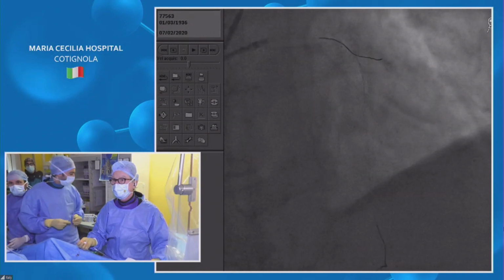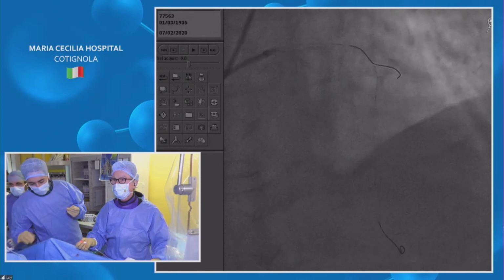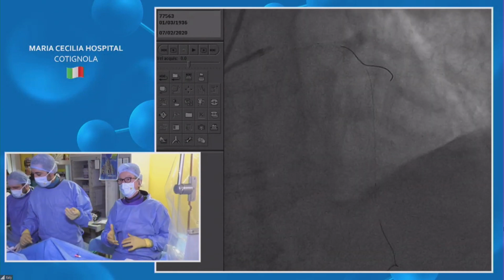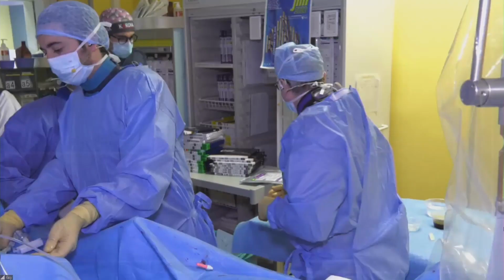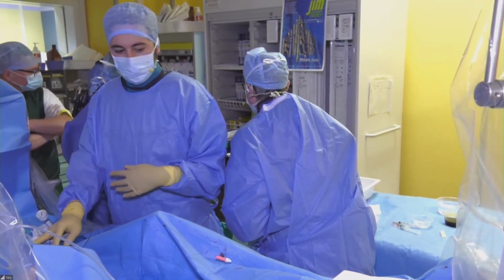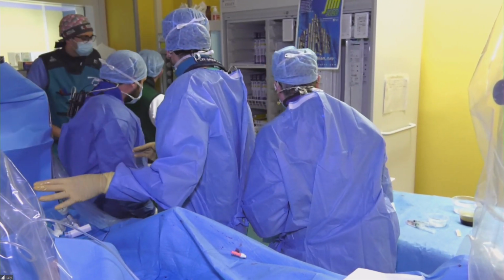Okay. Small test. Okay, I think it's enough to give me another introducer. And okay, give me a 3.5, 12 stent. No, 40. 3.5, 12. Standard. We don't jail them.